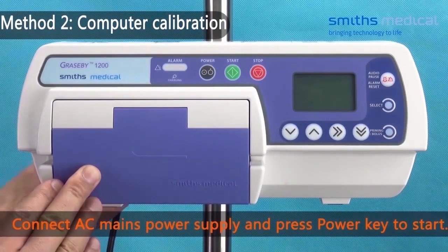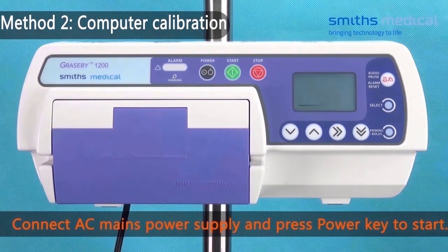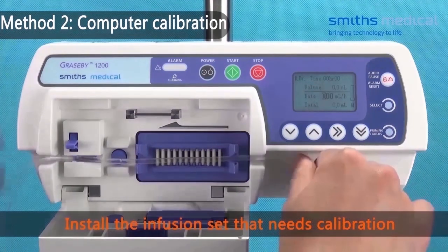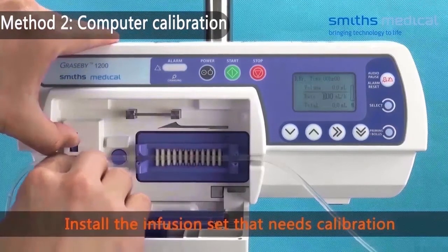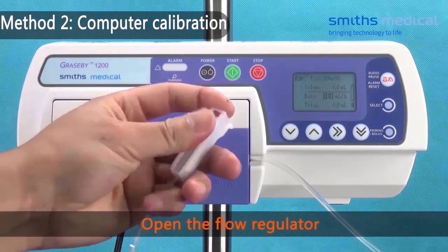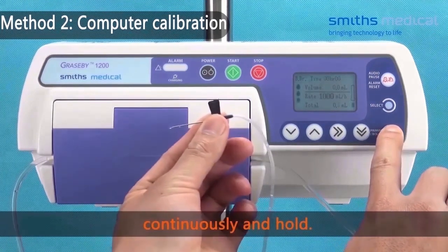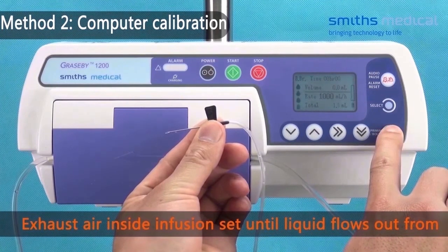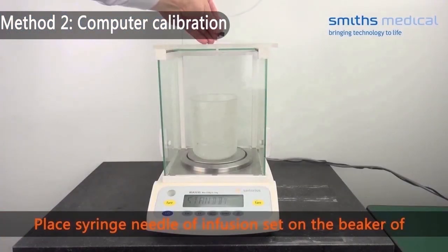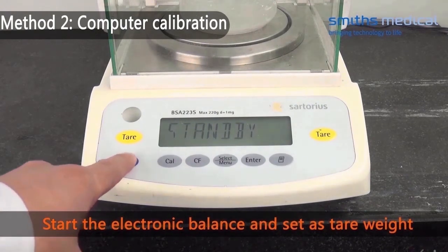Press the power key to start the electronic balance. Connect AC mains power supply and press the power key to start the pump. Install the infusion set that needs calibration. Open the flow regulator. In the stop state, press the priming bolus key twice, continuously and hold. Expel air inside the infusion set until liquid flows out from the tip, then loosen the priming bolus key. Place the syringe needle of the infusion set on the beaker of the electronic balance. Start the electronic balance and set as tare weight.